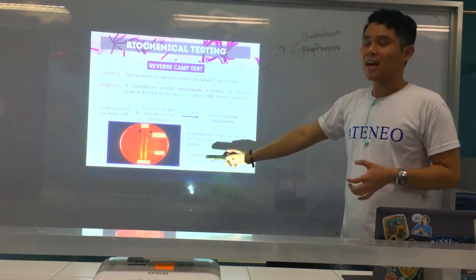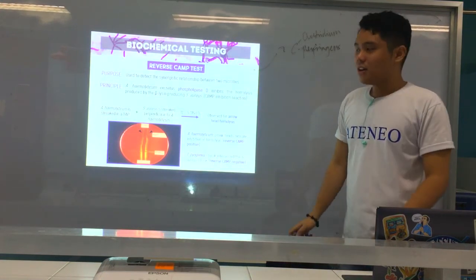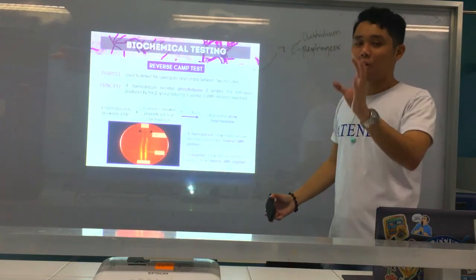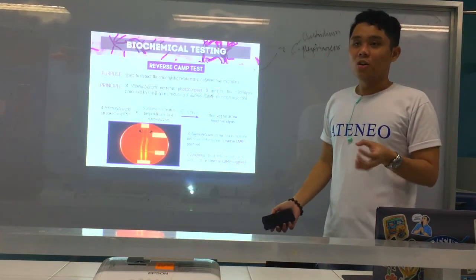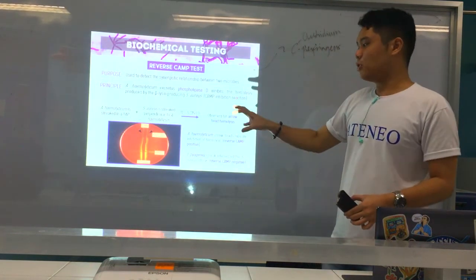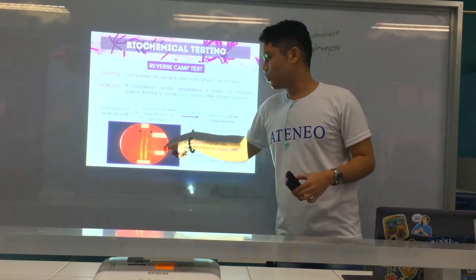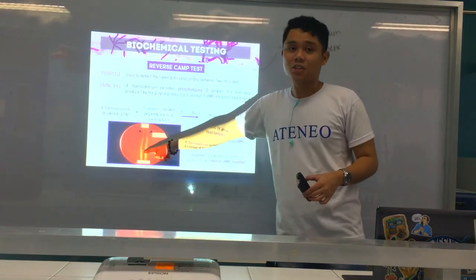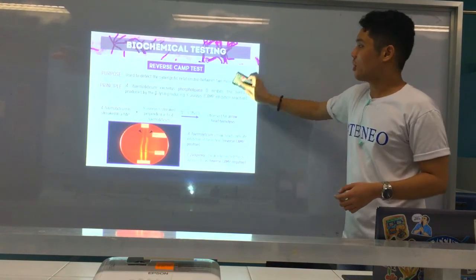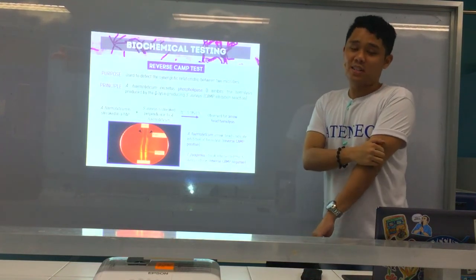But for A. hemolyticum, again, remember, phospholipase D inhibits the beta-lysin produced by S. aureus, so what happens is inhibition. As you can see, the appearance is like an arrowhead. But according to Mahon and Bailey, they don't mention what the positive reaction is. According to the picture, just take note that Arcanobacterium does not continue to grow into the streak of S. aureus, unlike Trueperella pyogenes, which continues to grow, because of the presence of phospholipase D. Okay, alright. So for the next part of the video, we'll go to the remaining tests for your gram-positive bacilli.